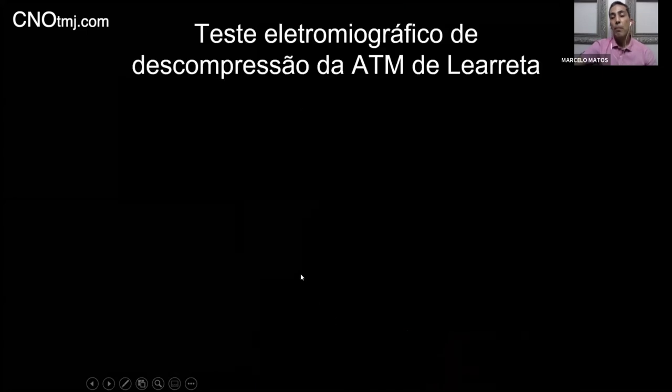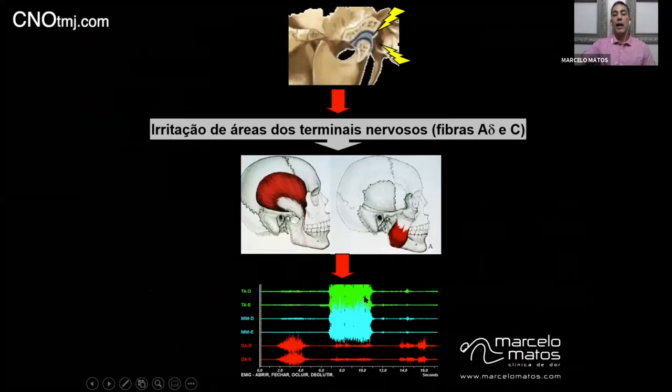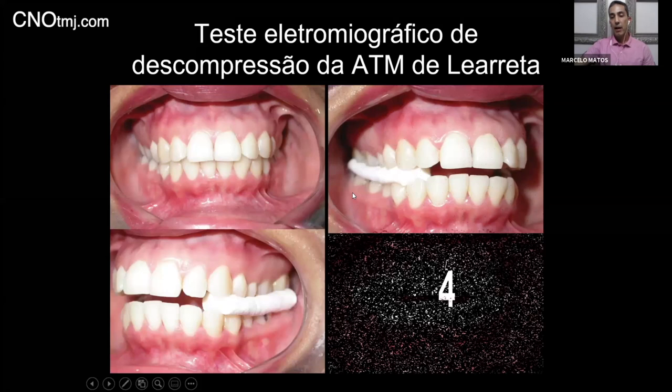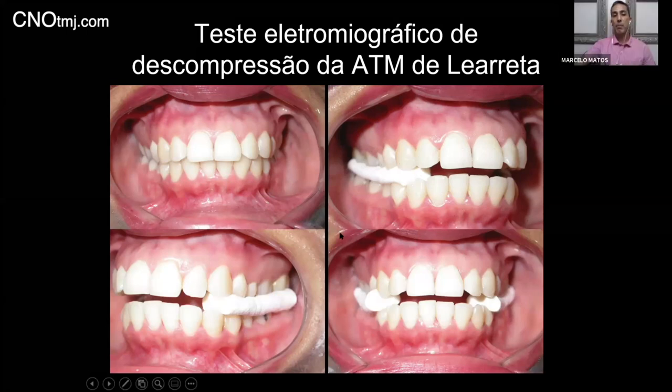So the problem with the EMG is that you cannot have a cutting point, as you have, for example, for blood analysis, where there is a number and you will get positive to a specific test or negative. So there is a person with a muscle finding just like this, and I need to understand if this is good or not for that particular person. How do we do that? We take a step further and we apply the test that you can see in the paper. I think Nick had sent it before in anticipation for you all. These are the same pictures as the original paper. We're going to make the patient clench hard for about 4 to 5 seconds, following this sequence. Conventional occlusion, whatever you call it, maximal occlusion, habitual occlusion, the natural occlusion of the patient.